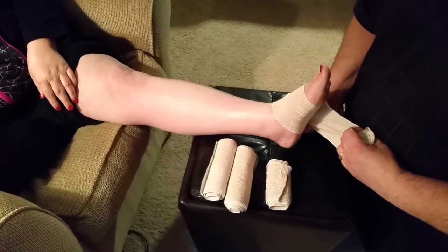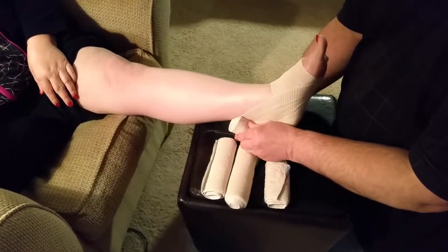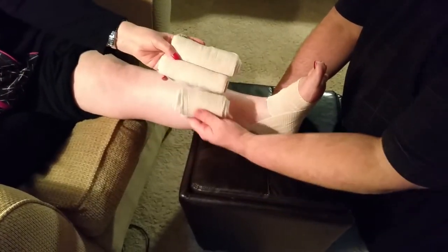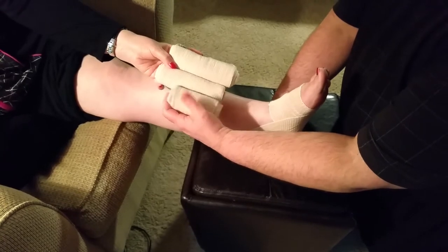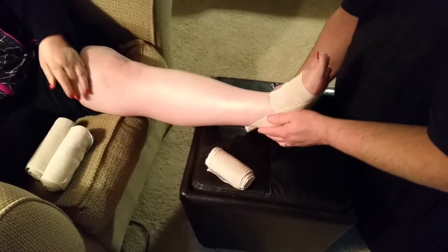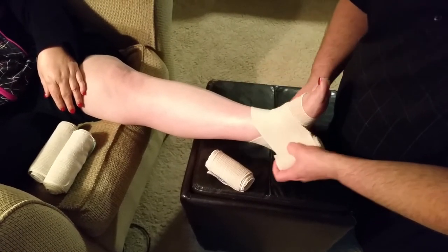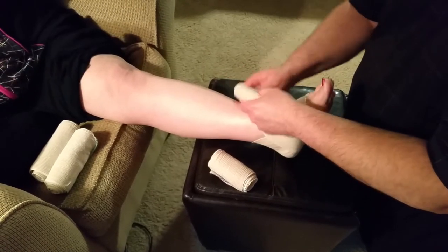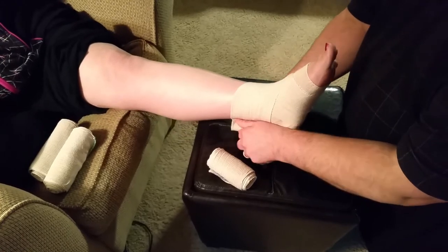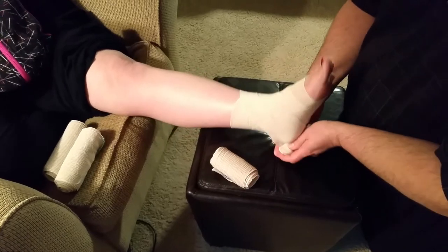Then what they taught me is to do a herringbone around the ankle. A herringbone comes across, down behind, and you'll need two different sizes — I think it's 10 centimeter and 15 centimeter. You go around this way and that way, and you end up with a herringbone look as you crisscross around.